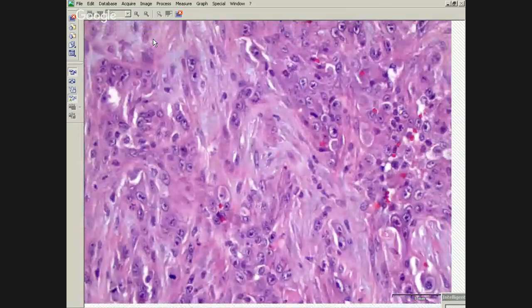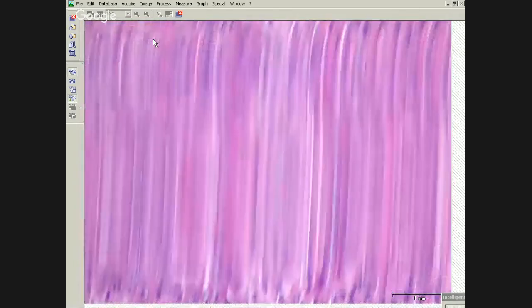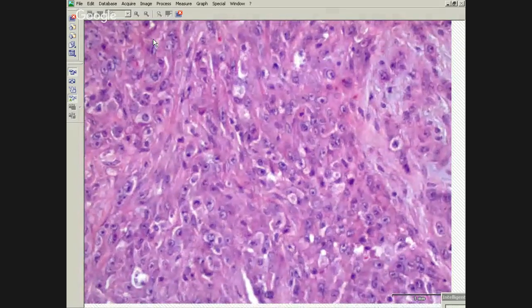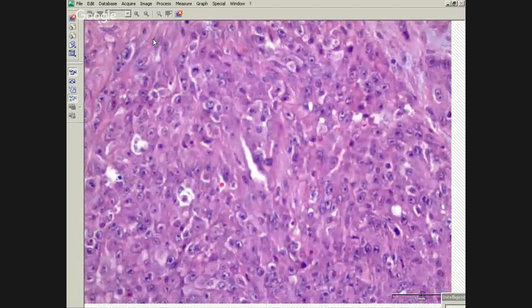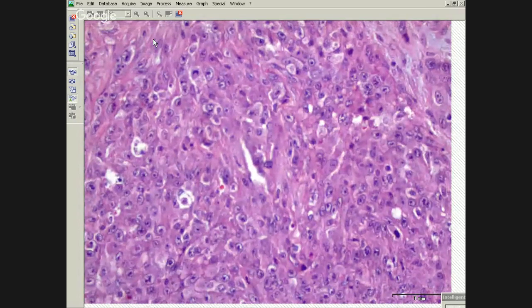Okay, so epithelioid angiosarcoma often is the thing that gets diagnosed after your first round of immunostains doesn't work out and you're thinking, oh, it's not mesothelioma after all. But that's why your keratin's important. Some of these epithelioid angiosarcomas will show some keratin staining, but you really shouldn't have the diffuse strong staining that's typical of a carcinoma or a mesothelioma. It's going to be much less. Similarly, your mesothelioma markers aren't going to be positive, so even if you skip the keratin, you're going to end up with this messed up panel that doesn't make any sense or it's not staining.